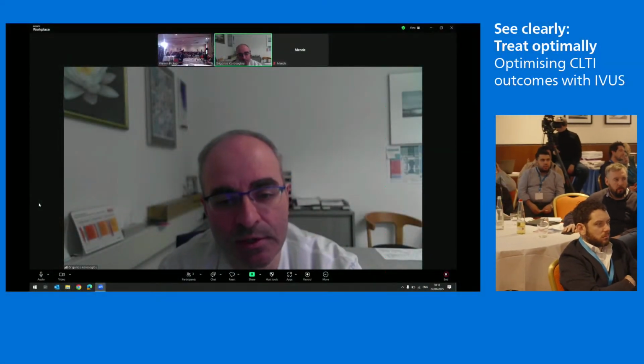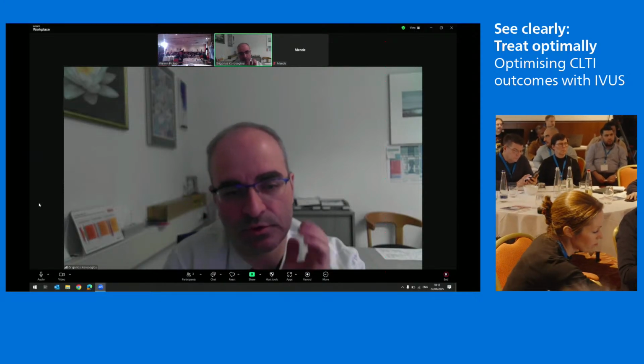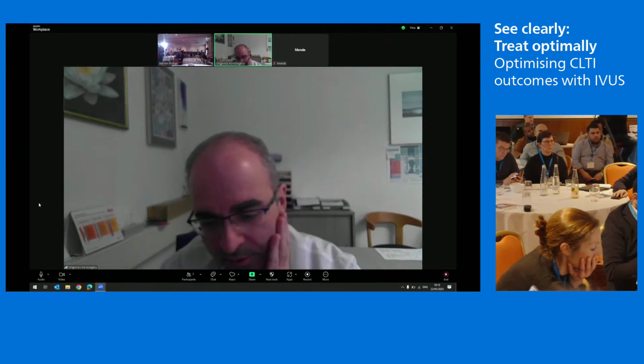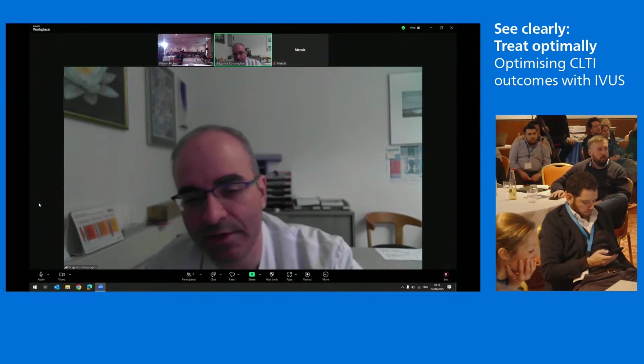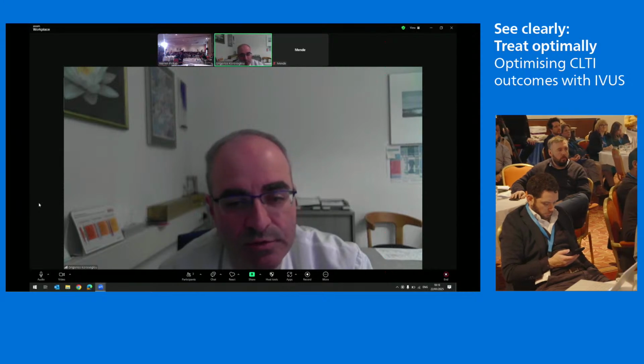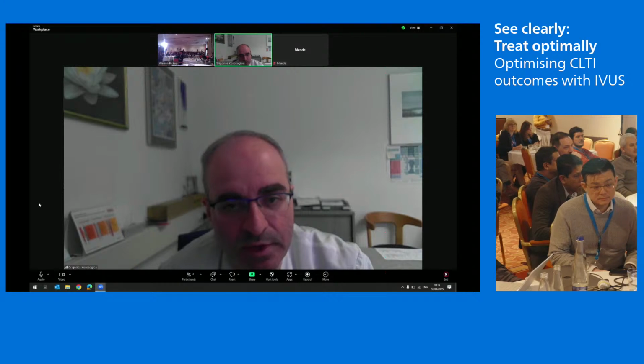Sure. Yes, thank you for the question. So this depends on the type of atherectomy device. So it's not a yes or no answer. Our experience with the Phoenix atherectomy devices, we never use filters actually. I've never used a filter with the Phoenix atherectomy device.